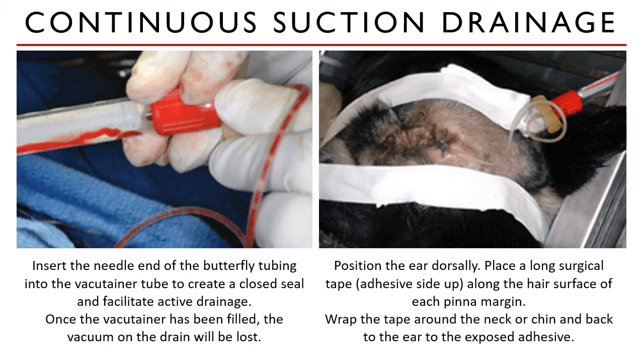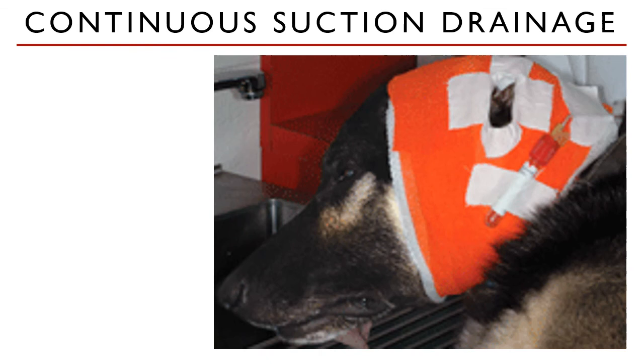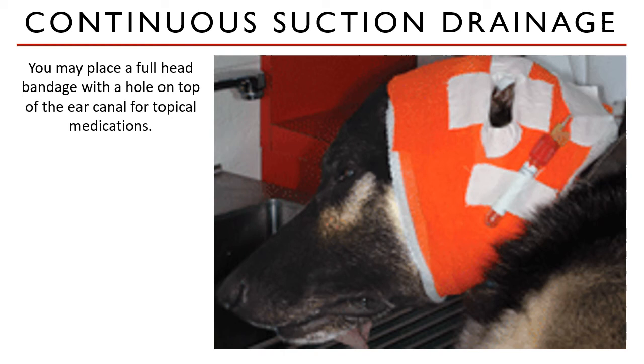The pinna is then positioned dorsally to expose the external ear canal and concave surface of the pinna. A full head bandage with a hole on top of the ear canal may be placed for easier administration of topical medications. Always be careful not to dislodge the vacutainer during bandaging, and secure the tube to the bandage with tape.